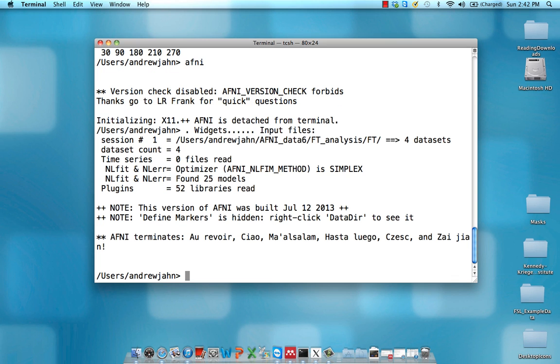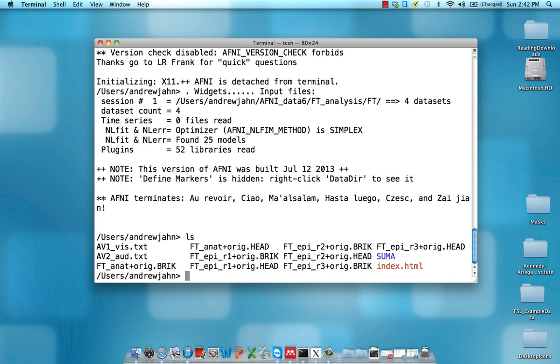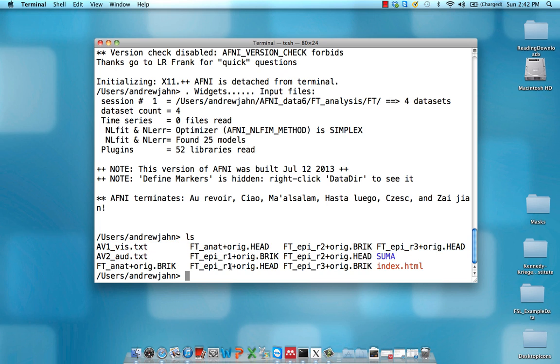Once you're happy with that, we've looked at both our actual data, so anatomical and functional runs, and also checked to make sure that these text files, the timing files, make sense and look okay.